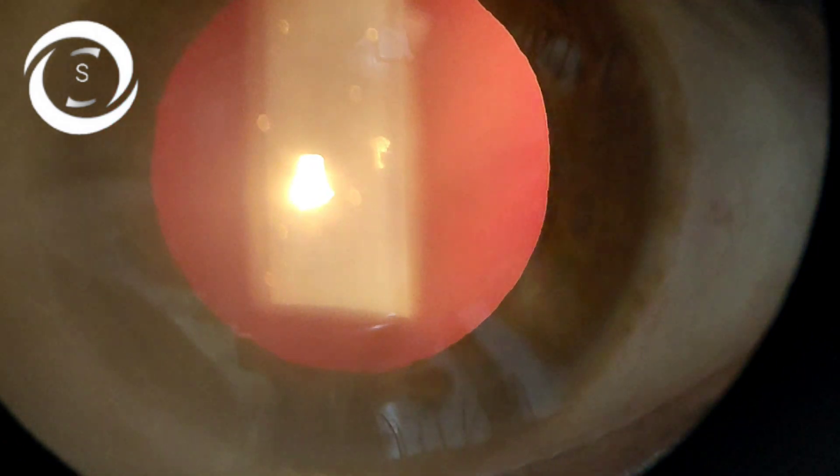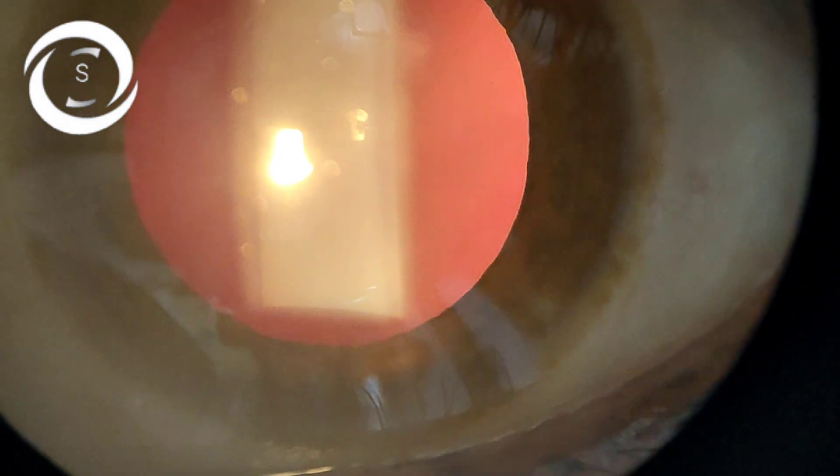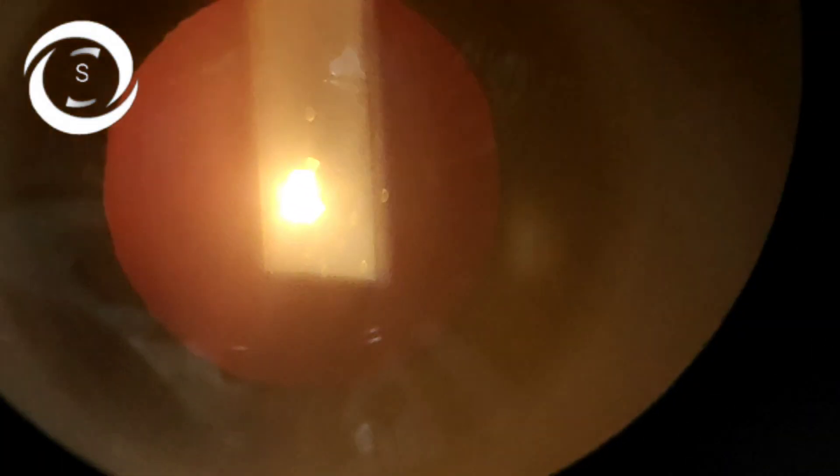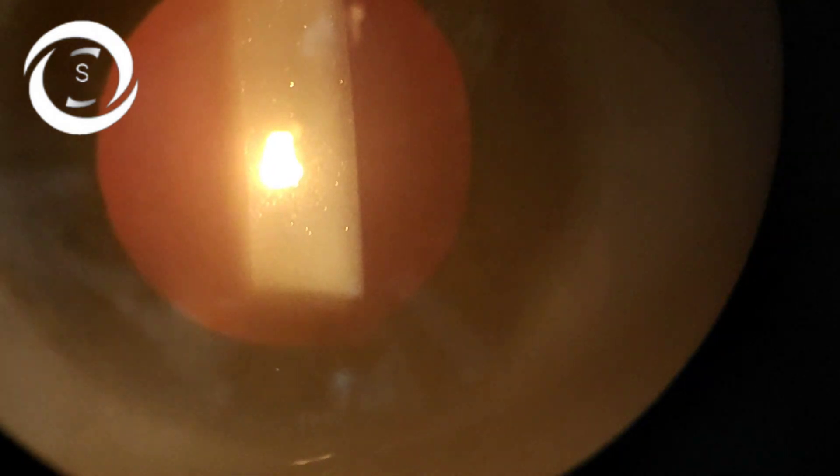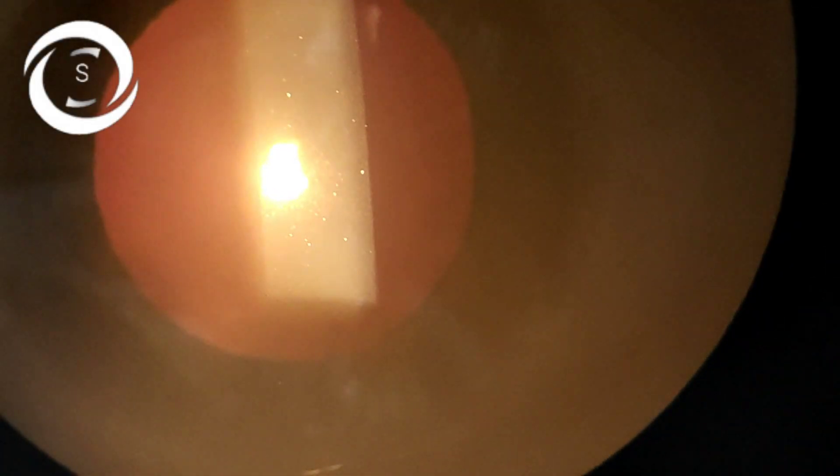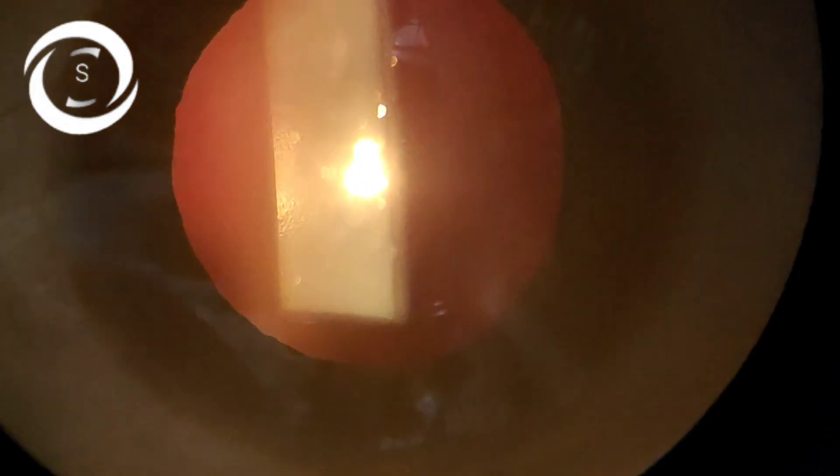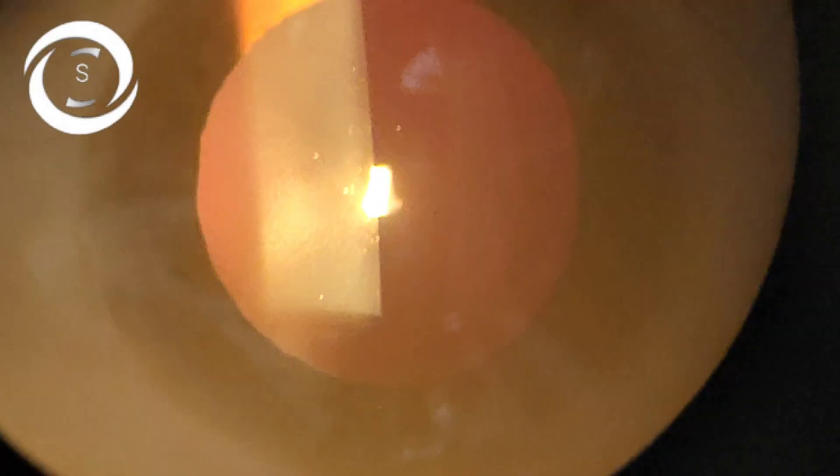Here you can see on the trans-illumination you can see the red glow, and the view is hazy on the 90 diopter lens. So you have to diagnose it. I have given you all the clues and you have to tell me the exact diagnosis. There is no history of trauma.